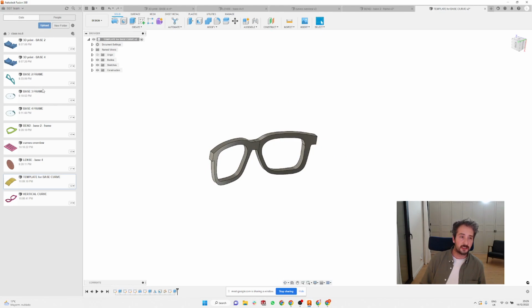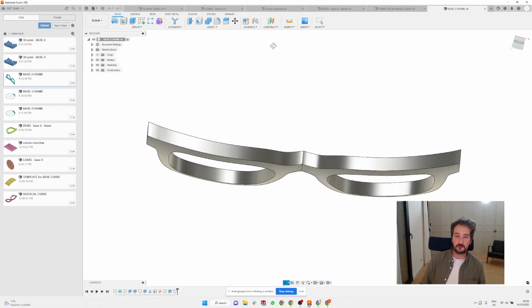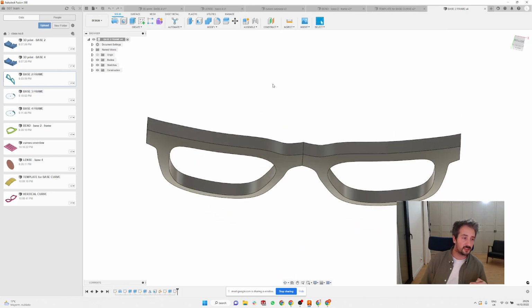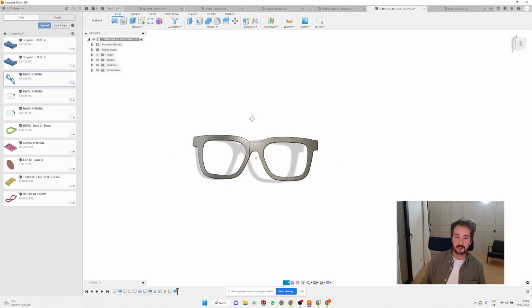It's also quite good because here I created several base curve versions. For example, this is one frame with the base 2 curve. But I'll definitely recommend, if you do 3D printing, use the method of just bending it like a sheet metal, because it's gonna get you closer to the right shape. If you use the method I showed you, you can see if you look at the front, the frame is actually not bent, it's just the same shape extruded against a curved surface, so it doesn't actually change the shape as normally happens when you are actually bending and heating up the frame. So I would definitely recommend doing it this way.